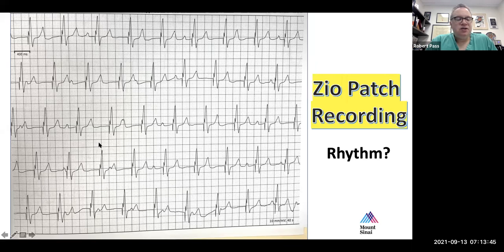And in small children, we routinely will put single chamber devices on. You can put a dual chamber device, but oftentimes single chamber is perfectly adequate. And when they're older, it can be upgraded to a dual chamber system. Okay, let's move on.